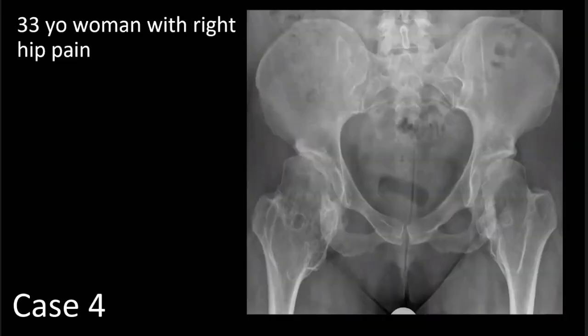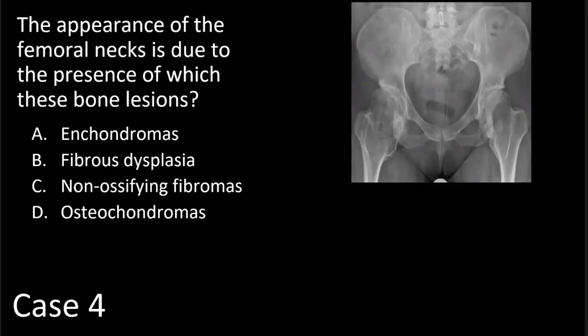Our next case is a 33-year-old woman with right hip pain. On this AP view of the pelvis, we see loss of the normal waisting between the femoral head and neck in a bilaterally symmetric fashion. We also see large, broad bony projections along the medial aspects of the femoral necks. And lastly, we see small ovoid lucencies with well-corticated margins in the femoral necks as indicated by the arrows. The question is: the appearance of the femoral necks is due to the presence of which bone lesion? Enchondromas, fibrous dysplasia, non-ossifying fibromas, or osteochondromas?